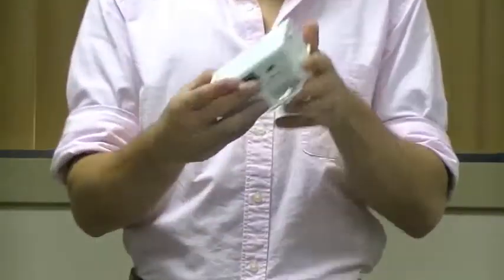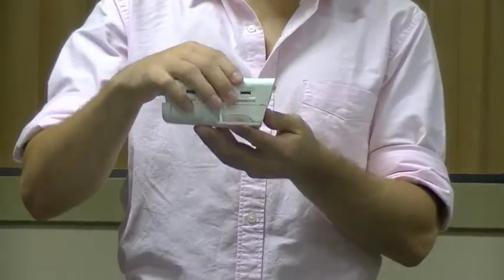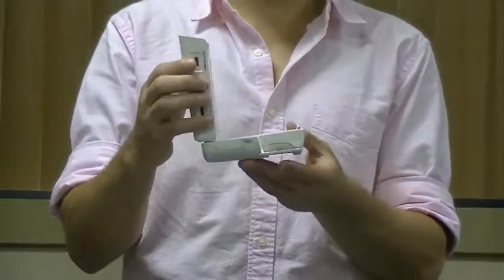The first step is to turn on the home sleep study. You will do this by opening the device and holding and pressing the power button.